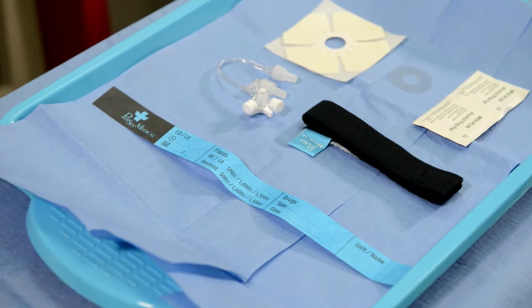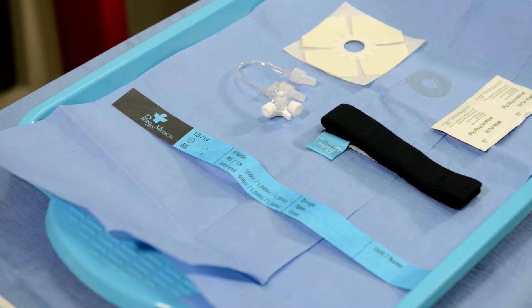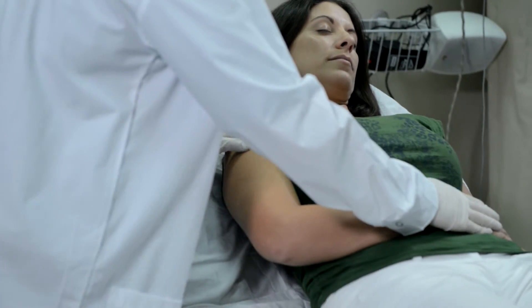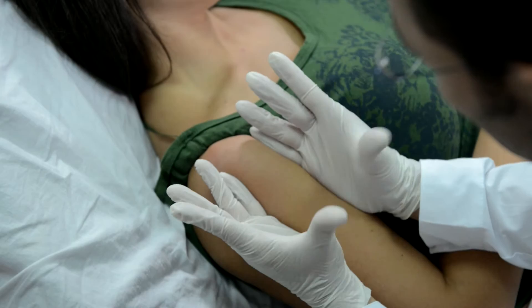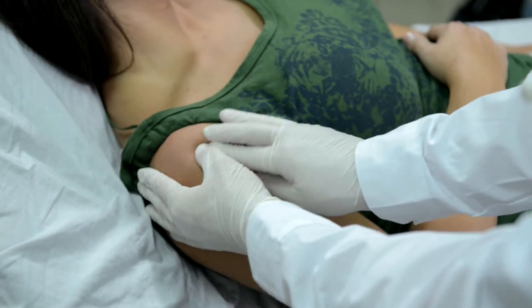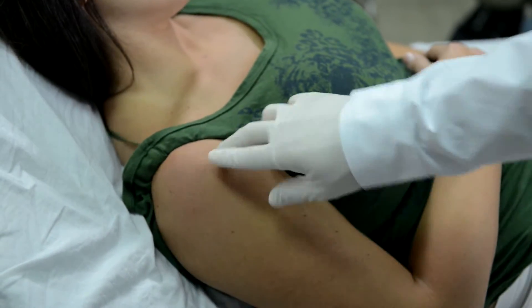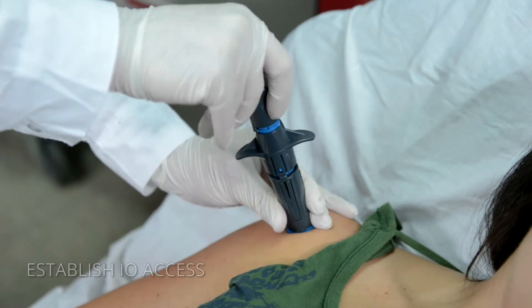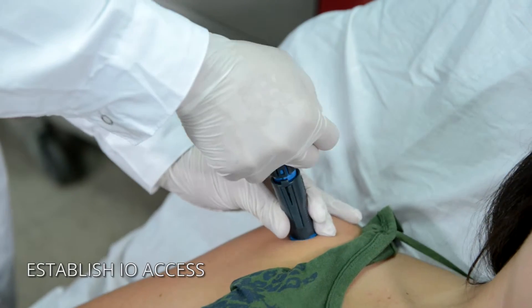The GO-IO kit contains all commonly utilized items for an I.O. procedure. Select the appropriate insertion site and use prep pads to clean the area. Deploy the NEO to achieve I.O. access.